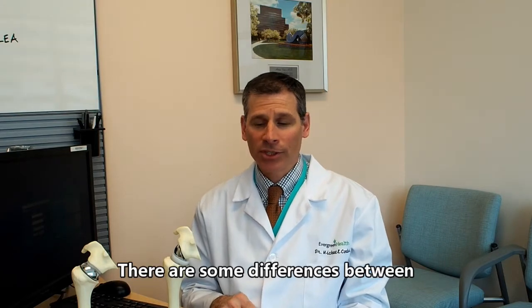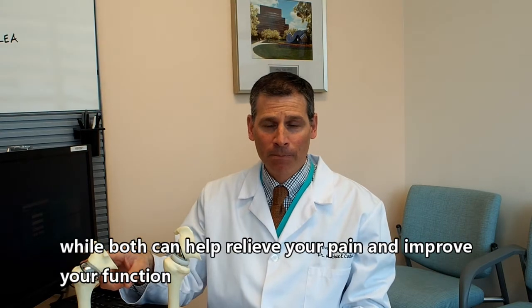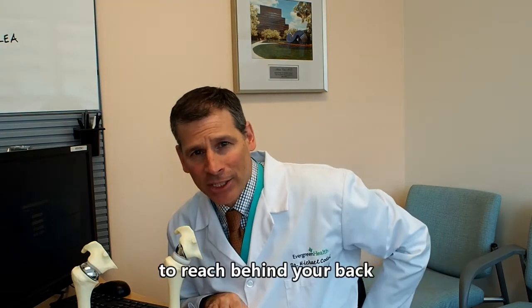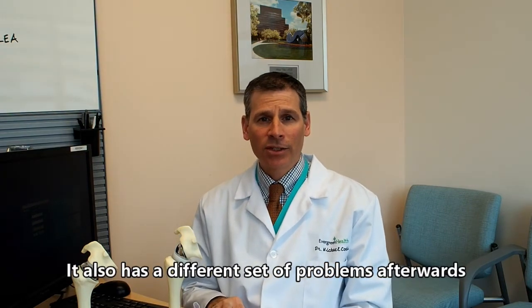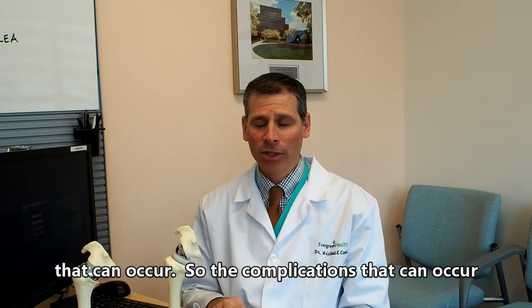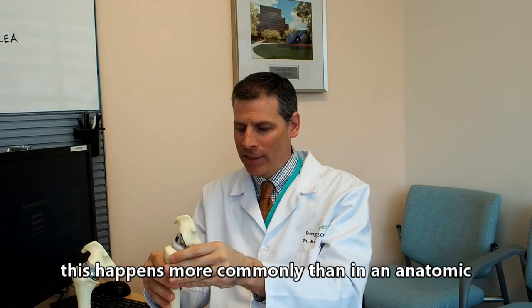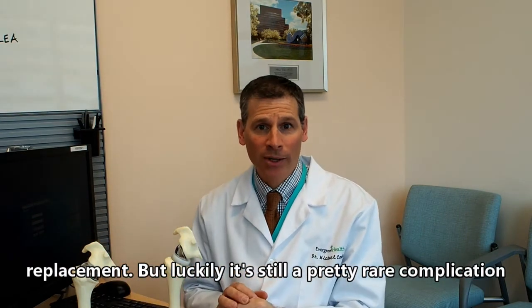There are some differences between a reverse replacement and an anatomic replacement. While both can help relieve your pain and improve your function, a reverse replacement makes it a little more difficult to reach behind your back. It also has a different set of potential problems — the ball and the cup can dislocate, which happens more commonly than in an anatomic replacement, but it's still a pretty rare complication.